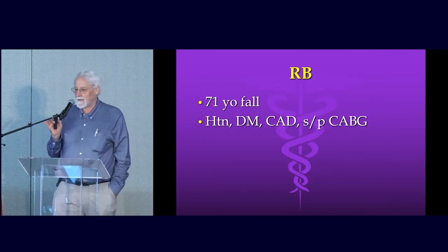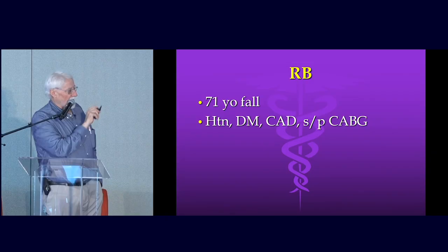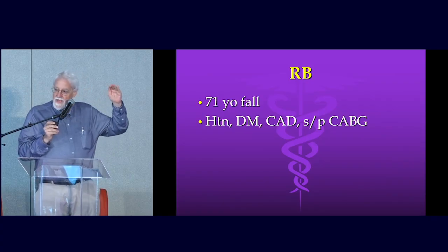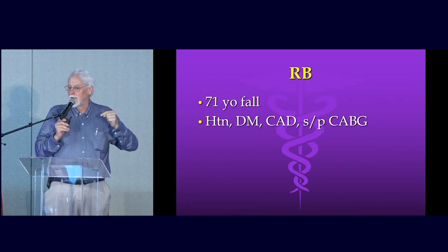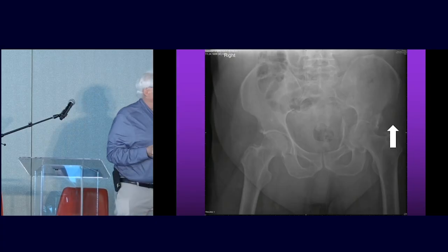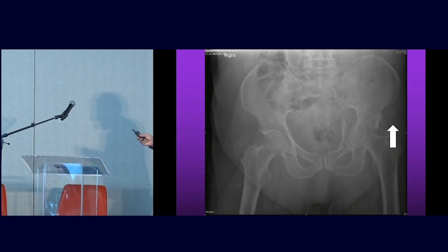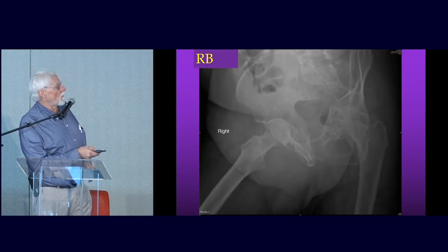So the thing I did with this case, and it's not really a case, but it's something we can talk about. It's a him, he has a lot more issues with some comorbidities. And I think the key is that medial impaction of the dome can look a lot like an anterior column, anterior wall. And so you have to be able to distinguish these two. Why I put this one in there is, right here, you might say, hey, that whole thing is an impaction medially. And I hopefully will prove, looking at it a little bit more, that this impacted area where the subluxation is, you see the head is subluxed.